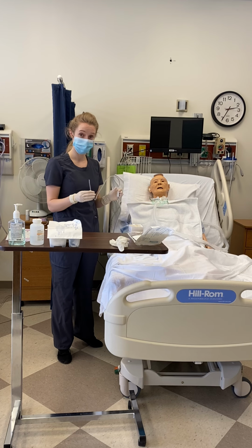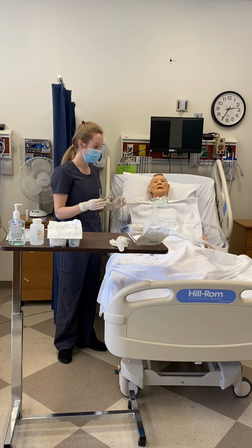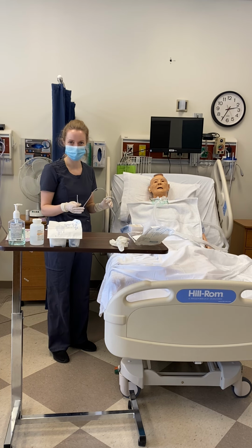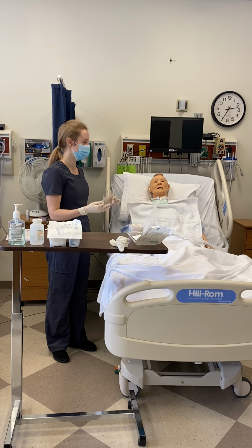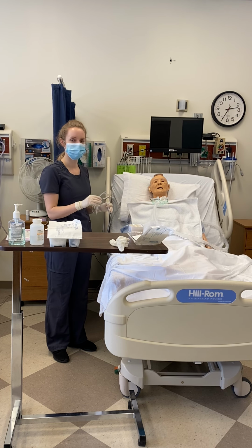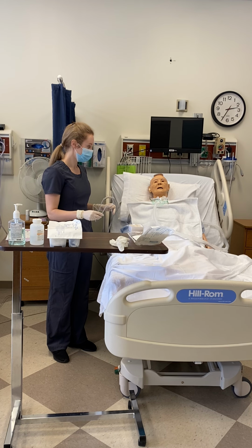Make sure that the next person who's suctioning has equipment at the bedside ready to go. And I want to document how Mr. Smith tolerated the procedure, breath sounds before and after, why I suctioned, the amount, color, consistency, and odor of secretions, and the number of passes and the size and type of suction catheter that I used.